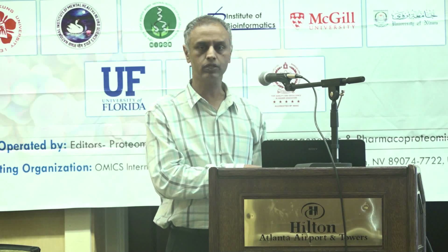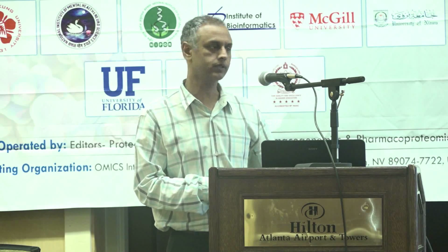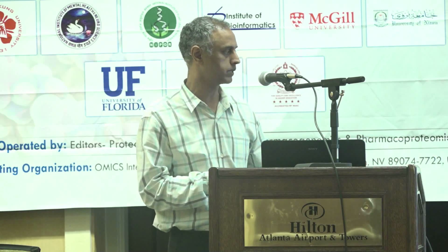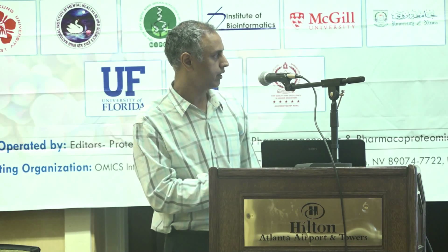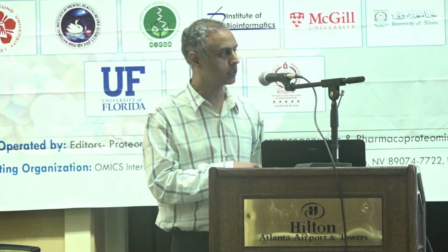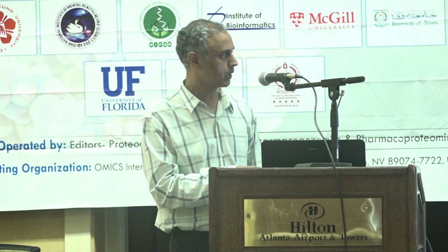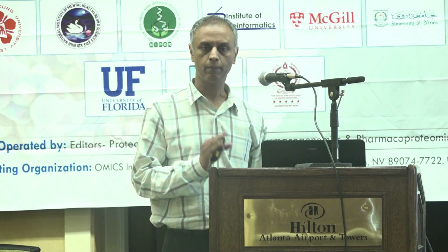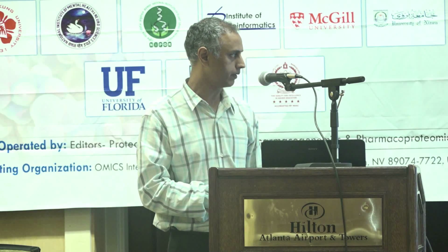So within a 5-minute time period of digest, that means this is a 10-minute processing, and we pretty much have instantaneous results. We are talking about a very small genome. In 10 minutes, we can basically figure out what is happening. And here, we can identify that it is Klebsiella pneumoniae for sure, but also that it makes this protein that is the resistance marker. This is a susceptible isolate where under the same parameters we identify the organism, but there is no peptide identified that comes from the KPC3 plasmid.